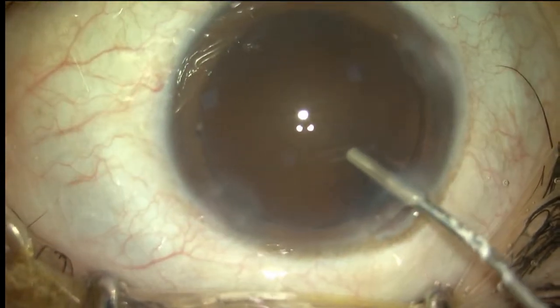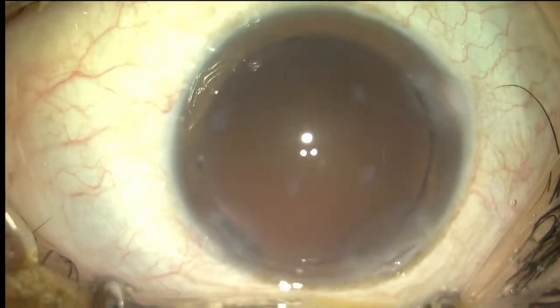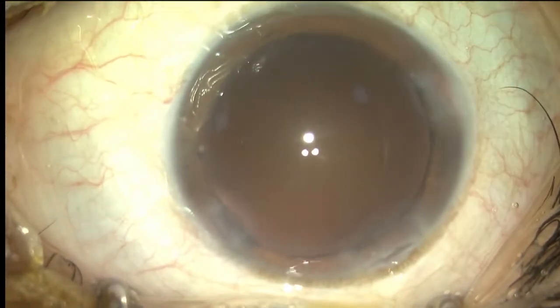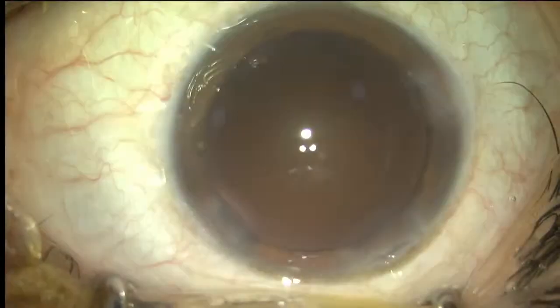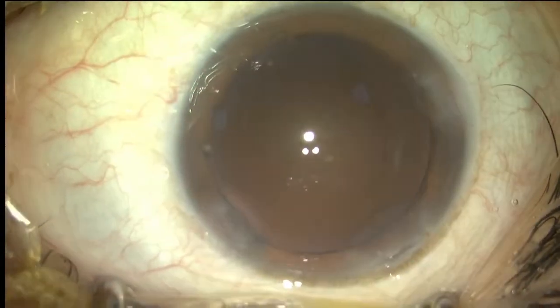I'm going to use Synergy. This is one of the best hybrid, you can say multifocal hybrid multi technology.